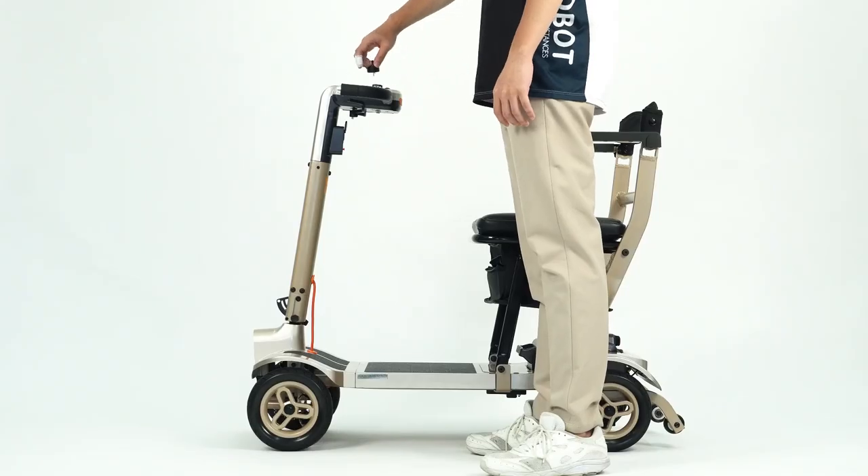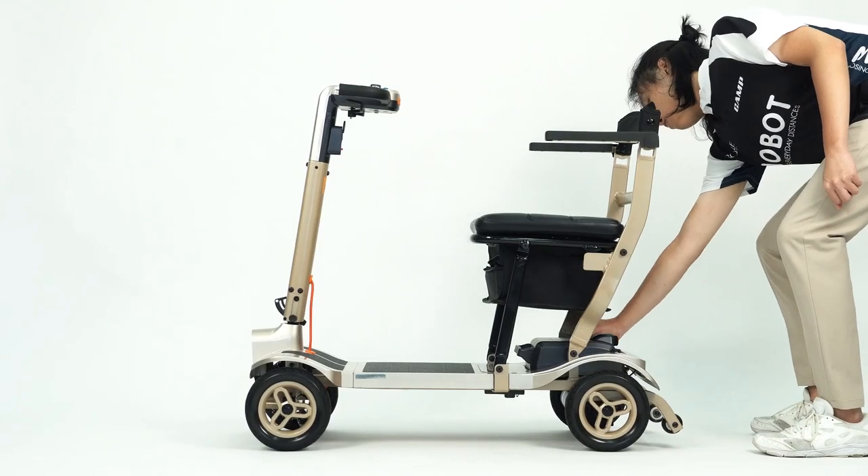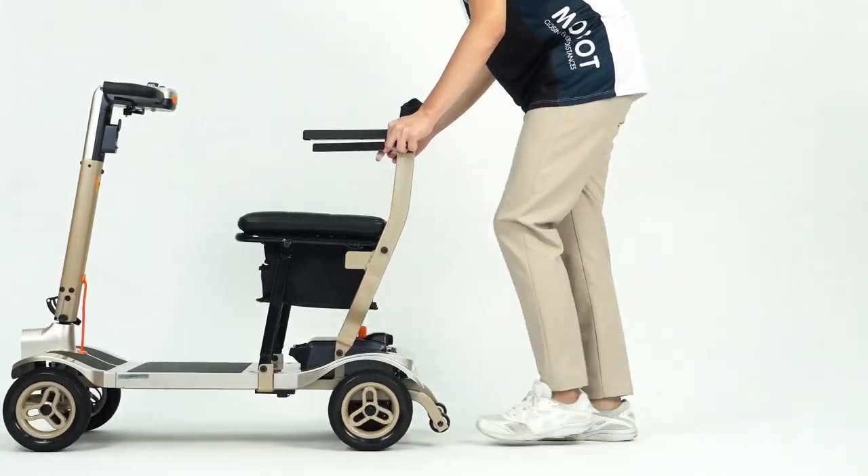Manual mode: Remove the key and push the orange clutch up to enable manual mode. You can now push the Opila light freely.